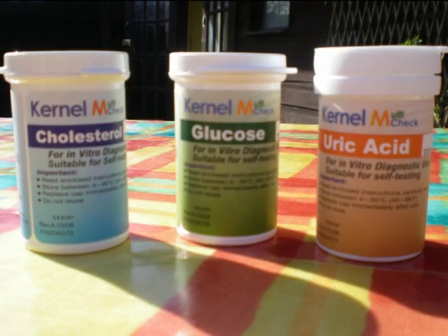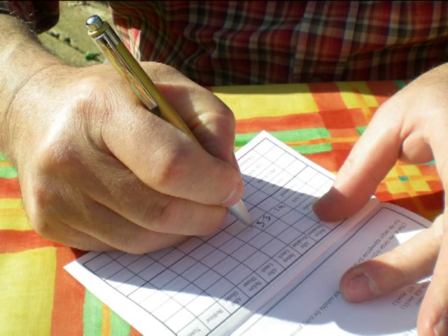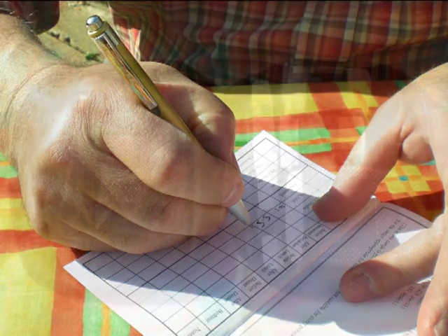The process is the same for whichever test you choose to take — simply make sure you place the appropriate chip in the machine and use the matching strips. Record the reading in the logbook to keep track of your progress. The meter automatically keeps track of the last 100 tests you do, however it is always good to keep your own record as well.